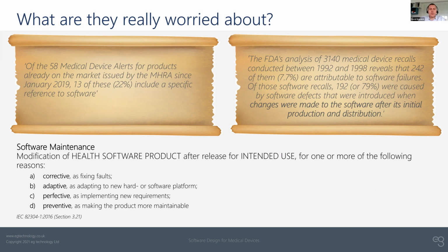But people familiar with developing software will realize that it's often not just about bug fixing. It's about making improvements to your system, improvements to your device, or adapting to new uses of your device over time. It's very easy these days, particularly if we're talking about software as a medical device, software that runs on general purpose IT equipment, to push updates out to the market.